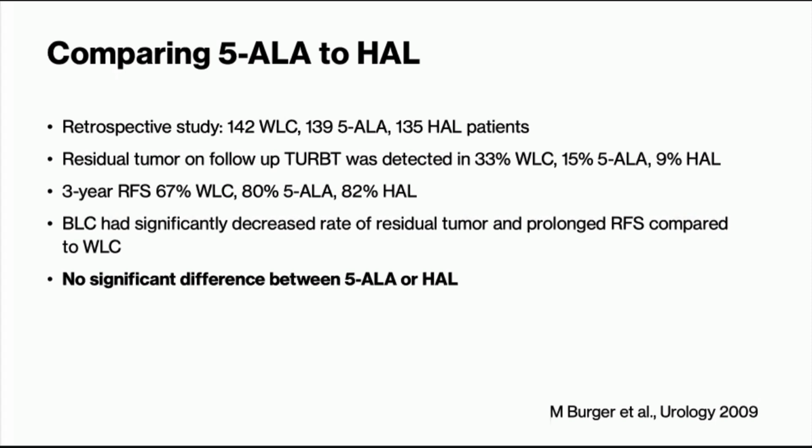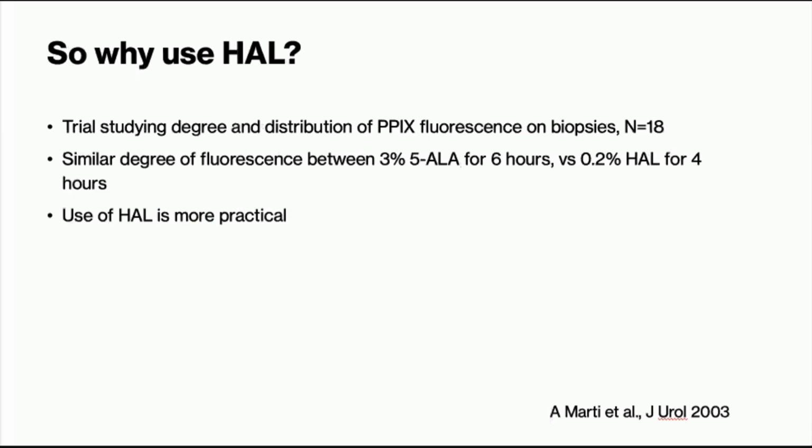So why bother using HAL or Cysview these days? Well, what we know is that because it's more lipophilic, it's taken up rapidly into cells. And so it's been shown that you can induce a similar degree of fluorescence by using HAL, but at a lower concentration and instilled for a much shorter period of time. So it makes it the more practical choice compared to 5-ALA. And as far as I'm aware, I think it's the only approved compound now in Canada.